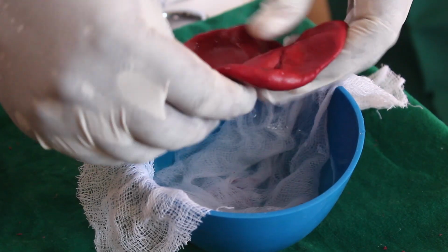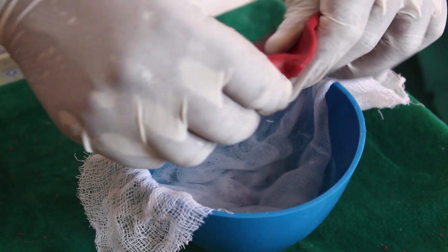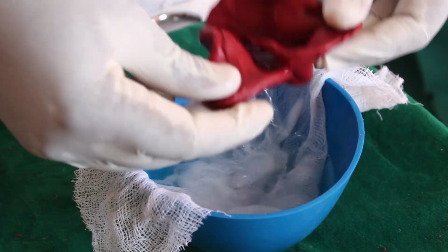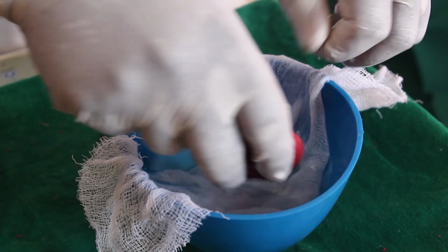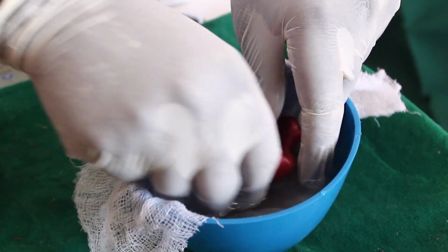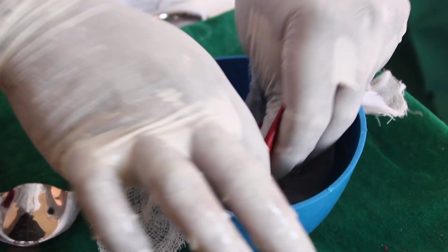I have taken one cake of impression compound. Based on the size of the impression that is going to be made, that is, based on the tray size you have chosen, you have to choose the material quantity also. If it is L3 or U3, then you have to take more than 1.5 cake. Since here it's a U2, I am taking one cake itself.